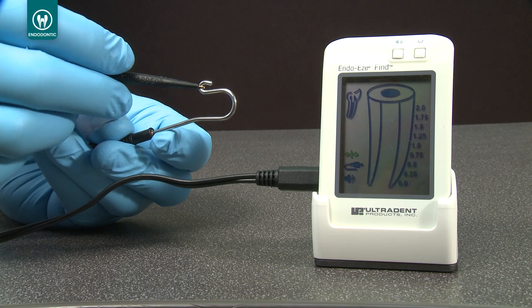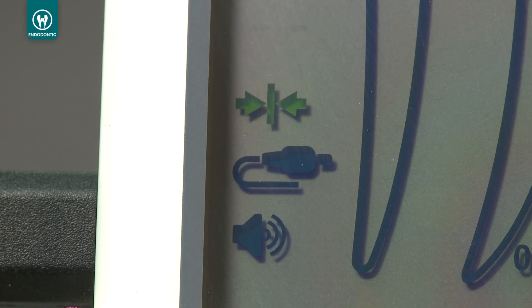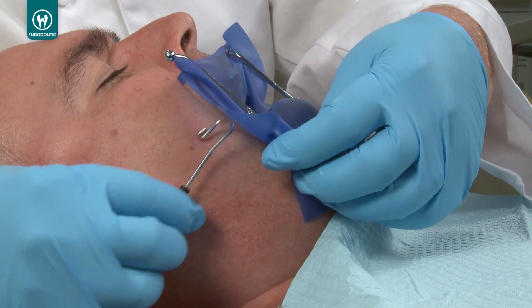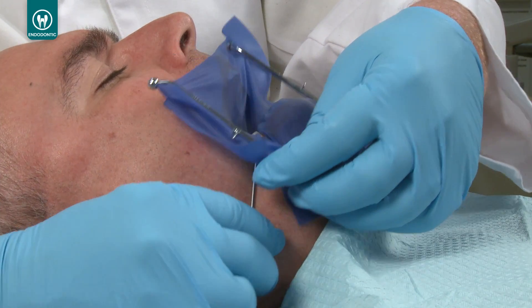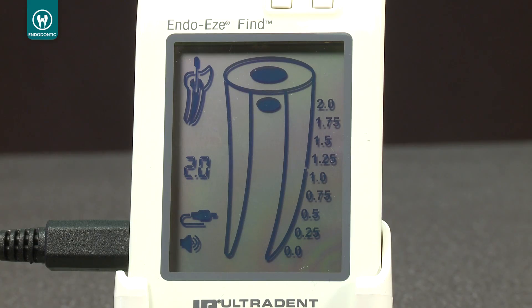Then touch the metal portion of the file clip to the lip clip. The connection icon should appear, demonstrating the electronic circuit is operating properly. Place the lip clip into the patient's mouth. Connect the file clip to the file. EndoEase Find will automatically detect that the root canal measurement has started.